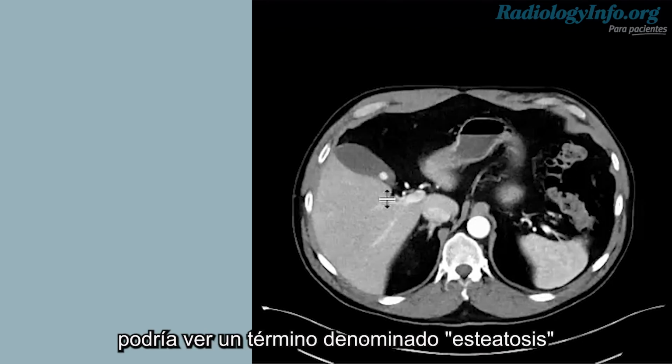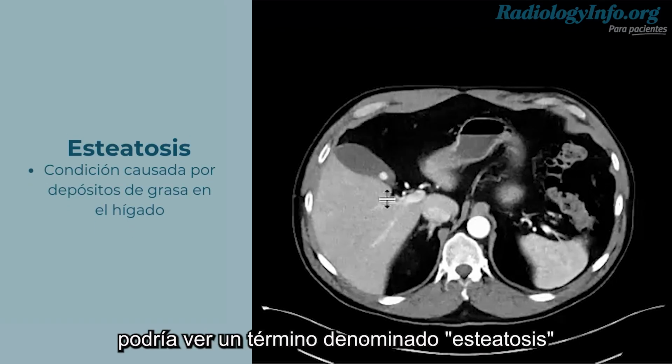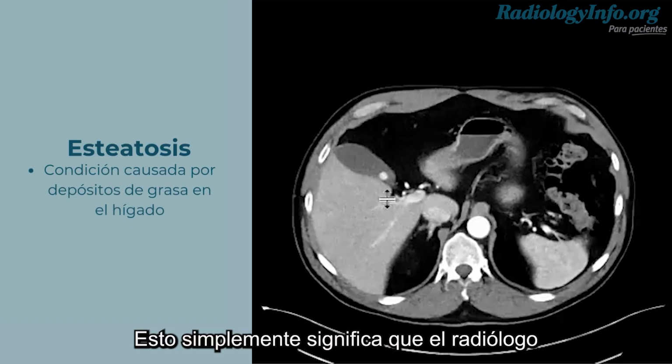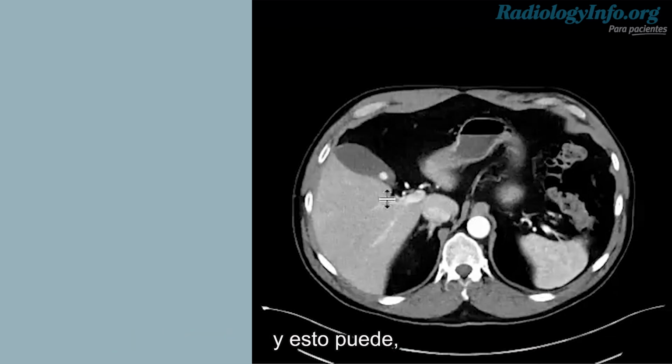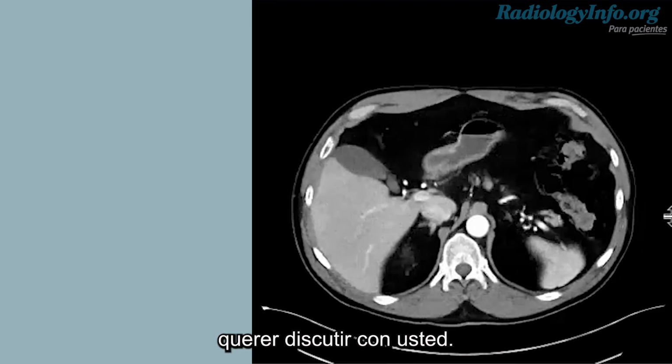When describing your liver, you may see a term called steatosis or steatotic liver. This simply means the radiologist thinks you have some fat deposition inside your liver, and this can sometimes cause lab abnormalities that your doctor may want to discuss with you.